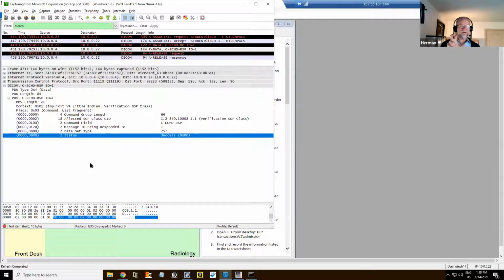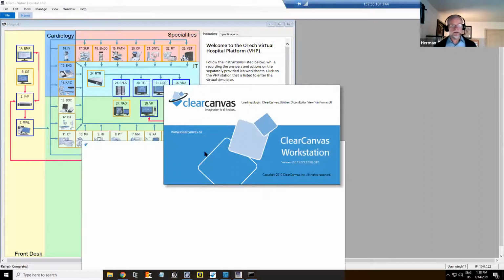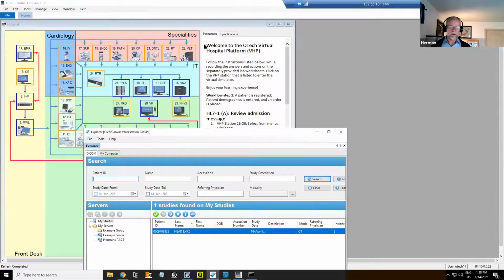So you should first do the verification so you get an idea of what's going on and really of the 3 phases. So now we can do anything we want. Let's do a workstation. That would be kind of fun, right? So we have a radiology workstation right here. And basically I use Clear Canvas. It's free, open source, easy to use, has a very nice help file. I use it for my home use, so to speak.